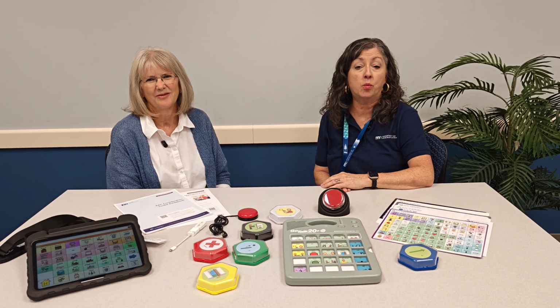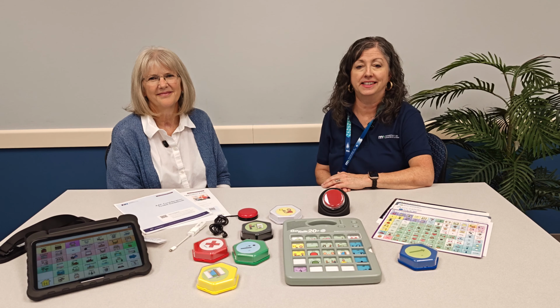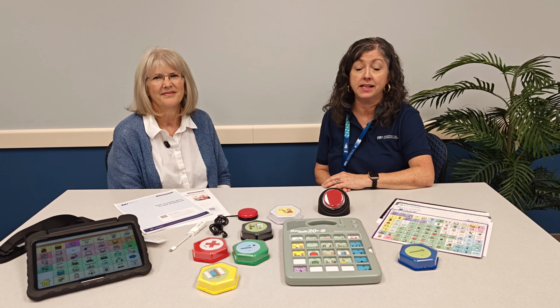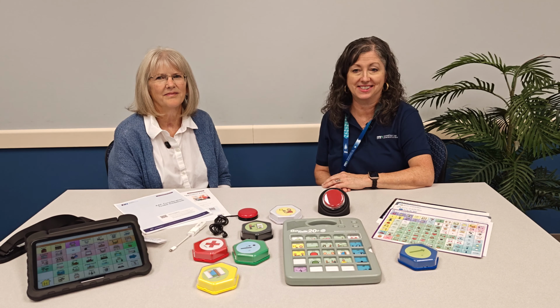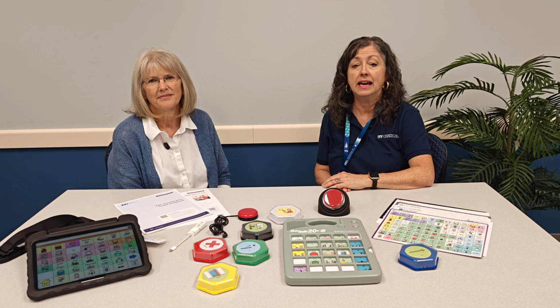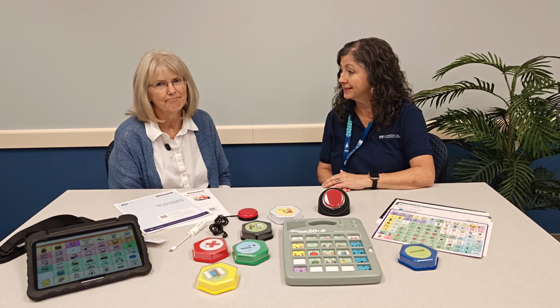Welcome. In this video, we'll walk you through how to use the AAC Consideration Toolkit. This resource was designed to help IEP teams and educators trial a variety of AAC systems with a student over 8 weeks. We'll show you what's inside the kit, how to use the guidebook, and how to collect data that will help determine next steps.